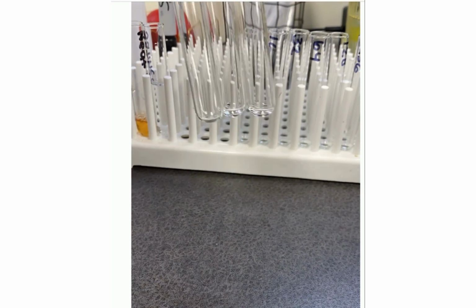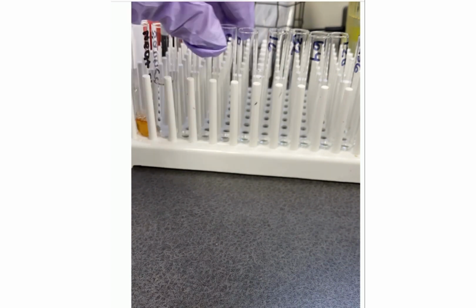I check to ensure that there is a visible liquid at the bottom of tubes 2 through 512. Again, as shown in this image, tube number 1 is a 1-to-1 dilution, therefore there is no saline remaining in that tube.